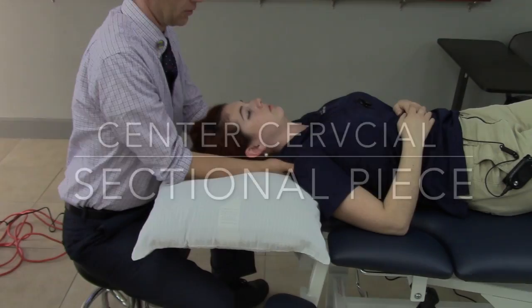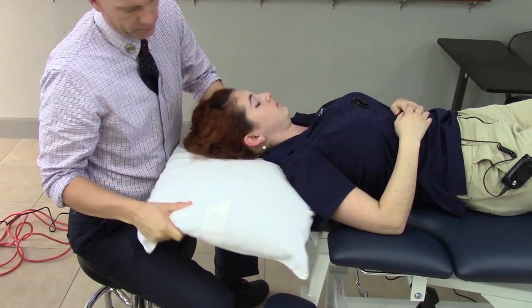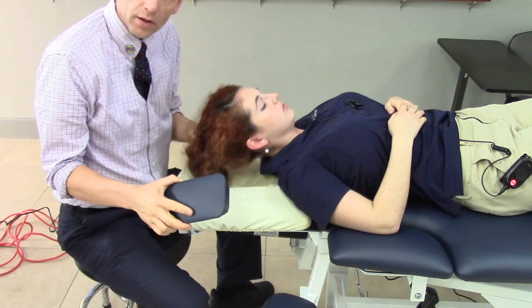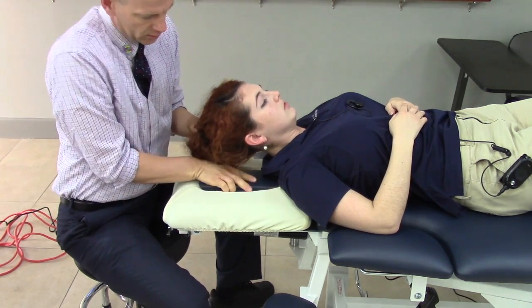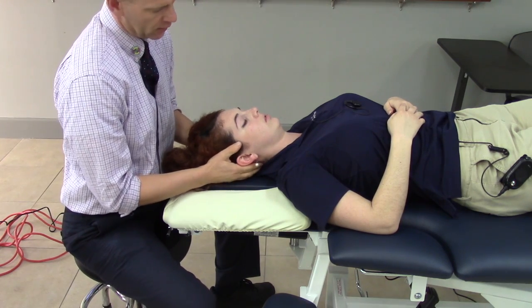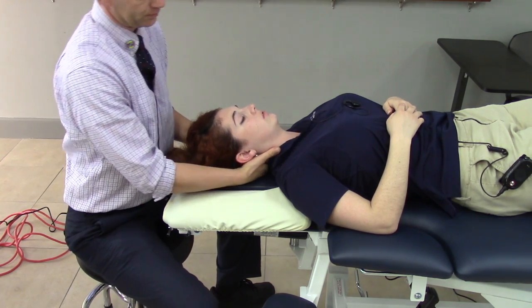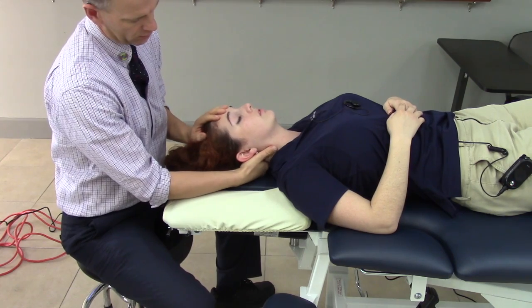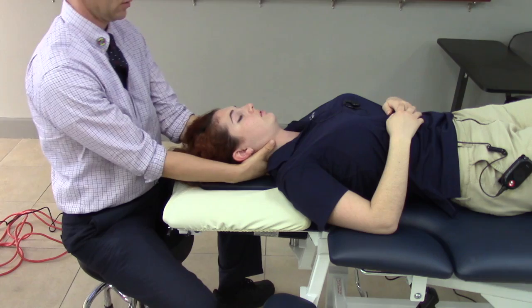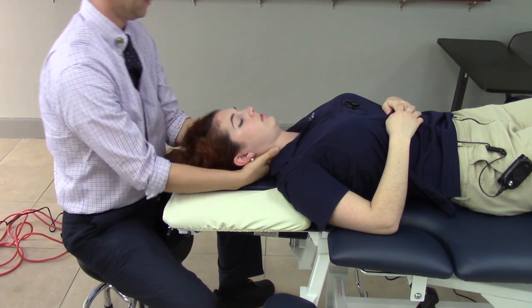There is a center sectional piece for when you want to position the patient in a more neutral position. Simply place it in the center of the cervical section and rest the occiput on the sectional piece. This allows more relaxation through the posterior ligaments during treatment.